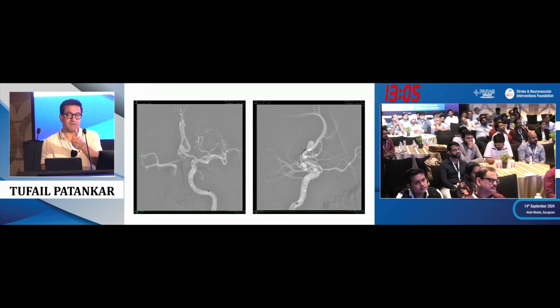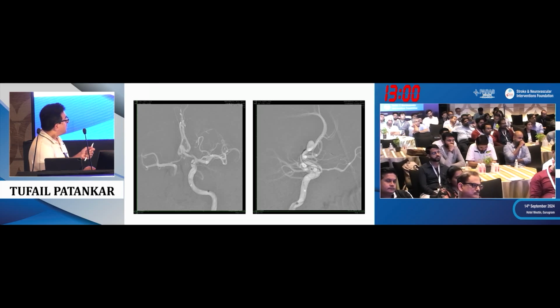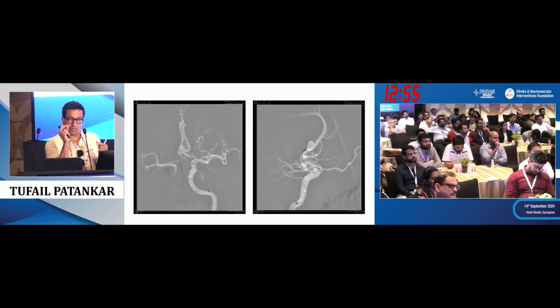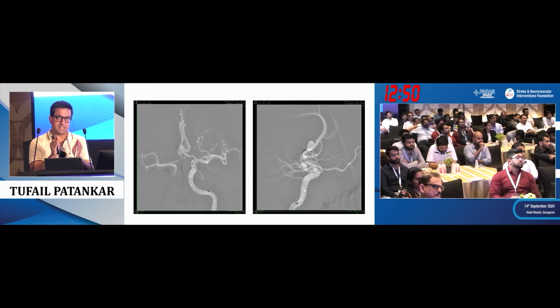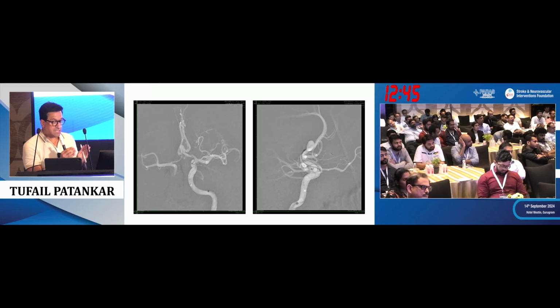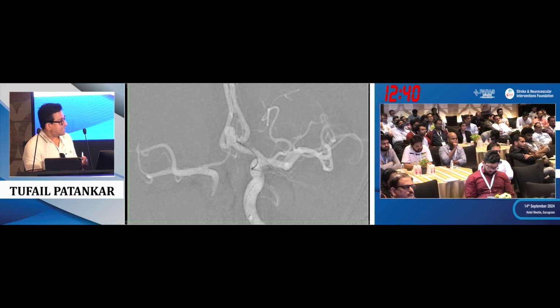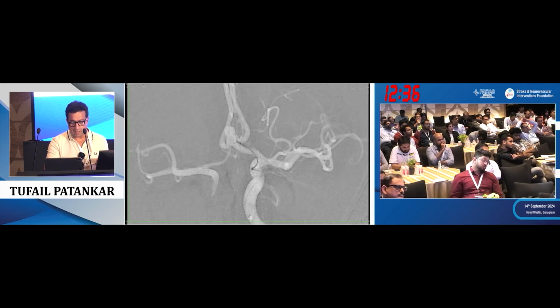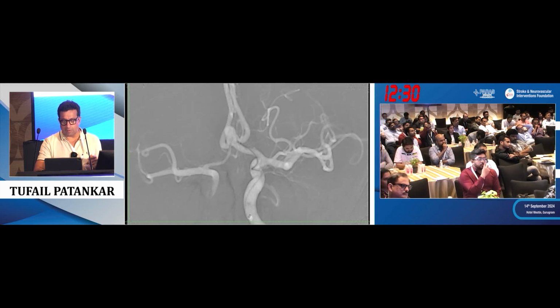Very important, like I said, when you are getting it up, you need to test that it is attached. When you detach it, you then have to expose this marker, but then you got to give a little bit of a kick to the device, because that's what we call a stabilization test. So you want to make sure the device is stable and it's not going to move. So here you can see now the device is here, and you can then manipulate the device. As you can see now, I can manipulate the device a bit more.